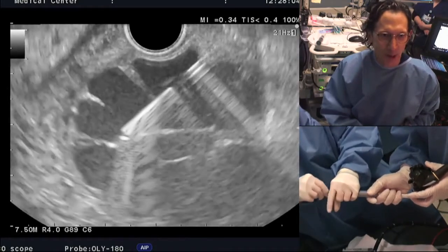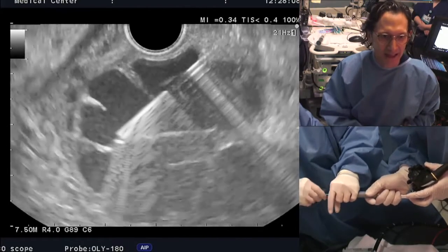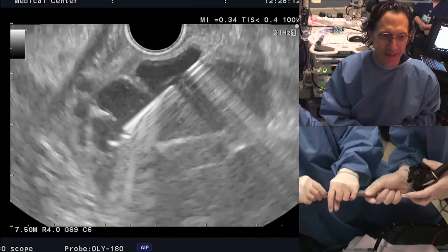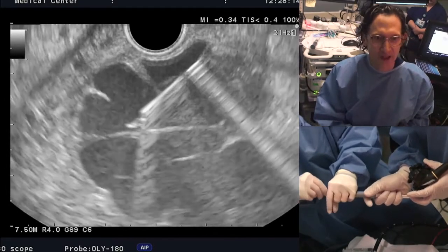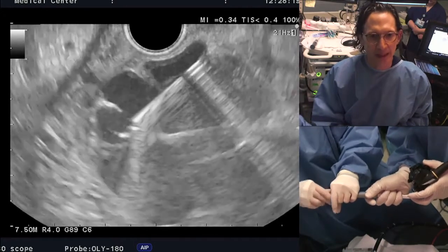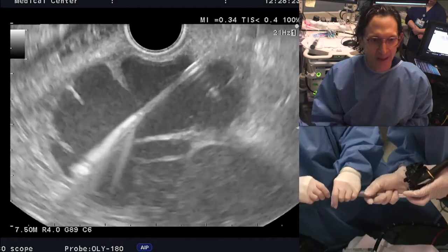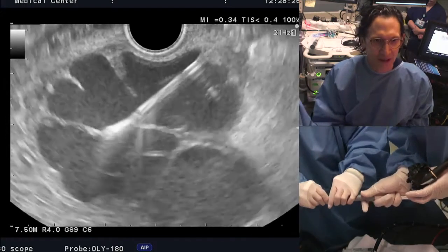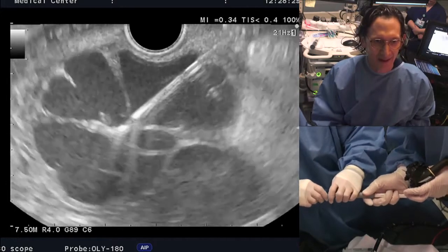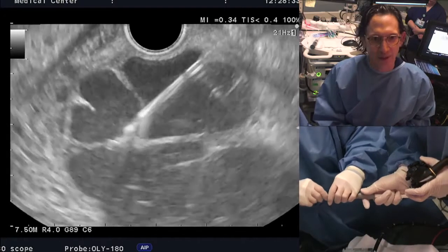I'm going to try to maximize. You know, this is like a roller coaster here. So these are like septae, but they communicate. So I'm going to see what the coil does when it starts to come out. And that's okay if I just place it here, but maybe I can get it to go in the lower half. I probably would rather go into the lower half. Let's see if I can do that or find a way to get it there. It's kind of, there's like a septum or a fold there.